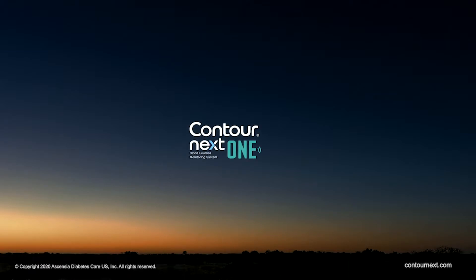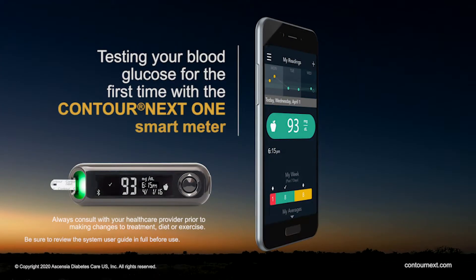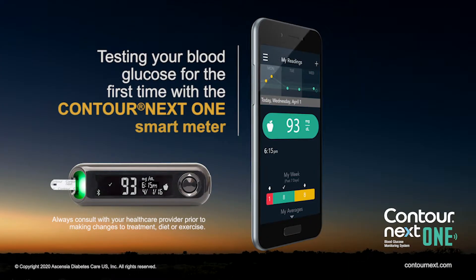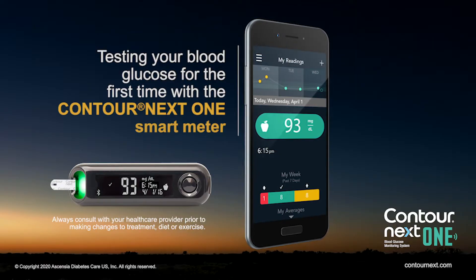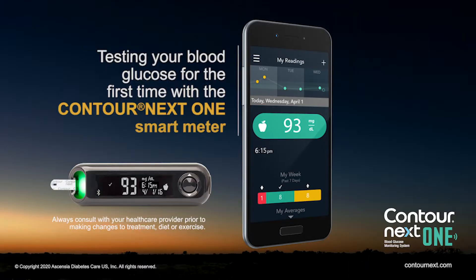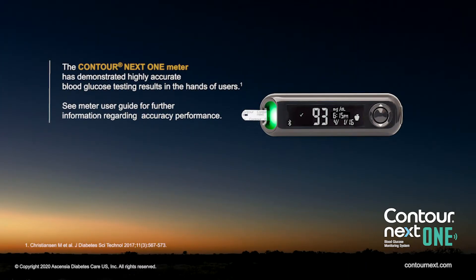Contour Next One Blood Glucose Monitoring System. Be sure to review the system user guide in full before use. This video will show you how to test your blood glucose for the first time with the Contour Next One Smart Meter. The Contour Next One Meter has been shown to provide highly accurate blood glucose results.